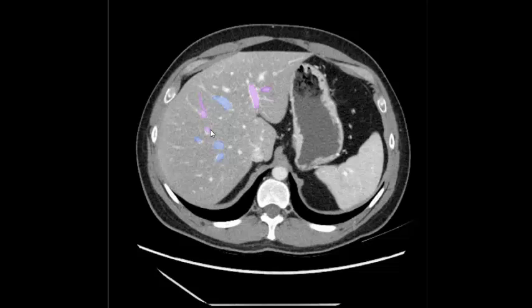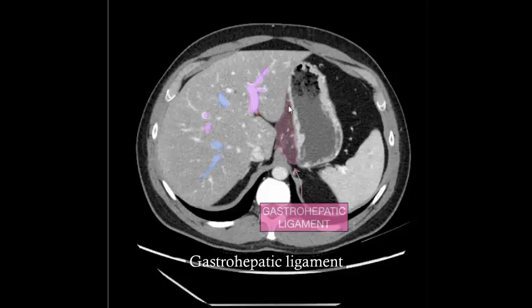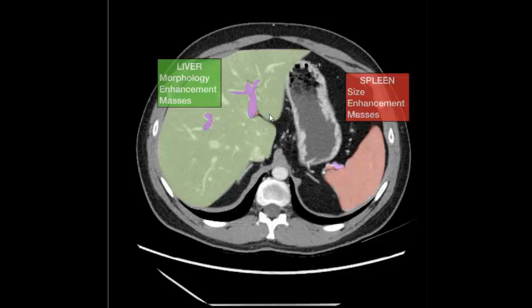Portal vein branches, stomach, abdominal aorta, spleen. Liver, hepatic vein branches, portal vein branches, gastro-hepatic ligament, abdominal aorta. Spleen, liver, portal vein, spleen, splenic artery, splenic vein, stomach, abdominal aorta.